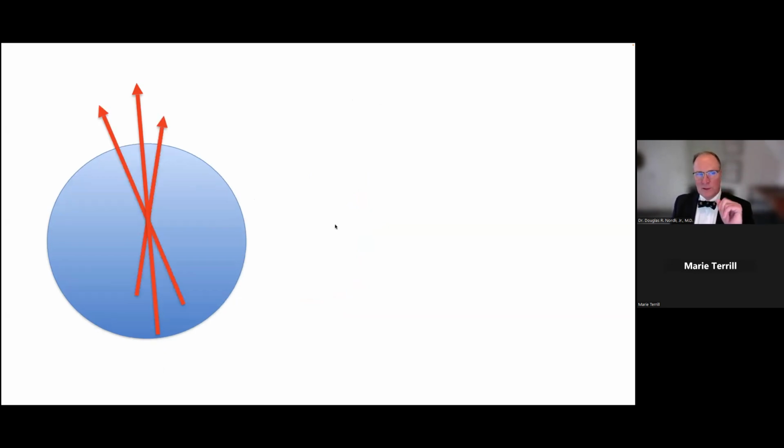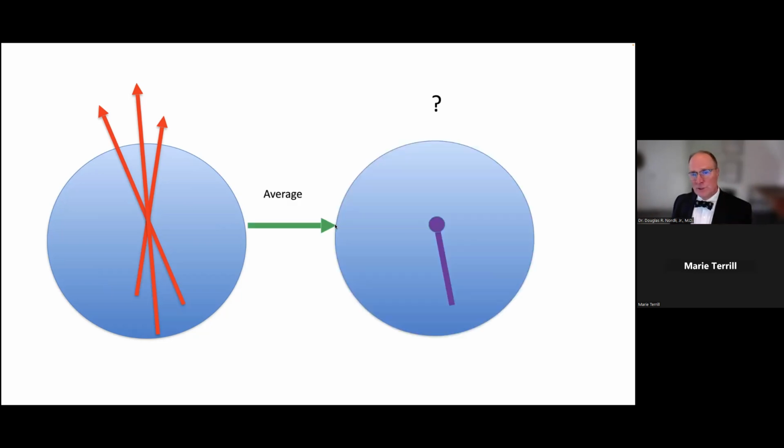Another way to think about it is to say, well, what if the spikes vary only a little bit? Can you rely on detection of spikes? Will it give us a reasonable answer to the problem of source localization? Because that hand picking of spikes can take quite a bit of time, and we don't have a lot of time, right? We're busy clinicians. So what if you average these? Would you get a result that's reasonable?